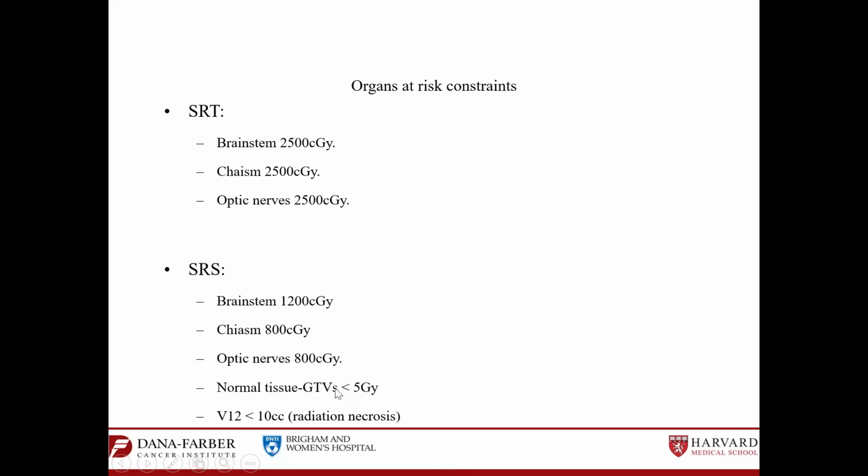So no, just to avoid the GTVs, you just subtract the GTVs where the tumor is, the volume of the GTVs, not the brainstem. The brainstem is a normal brain tissue. So brainstem will be a part of the normal tissue. Yeah. So as you are delineating for whole brain, the brainstem is from the whole brain, right? It's inside it, right? So it's a normal brain tissue.